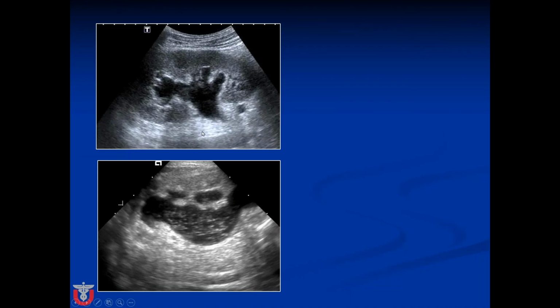Okay, patient comes in for rule out hydronephrosis. We get that a lot. And we have two different patients. One is really sick and the other is not. And you can make your decision who you think looks sick and who you don't think looks sick.